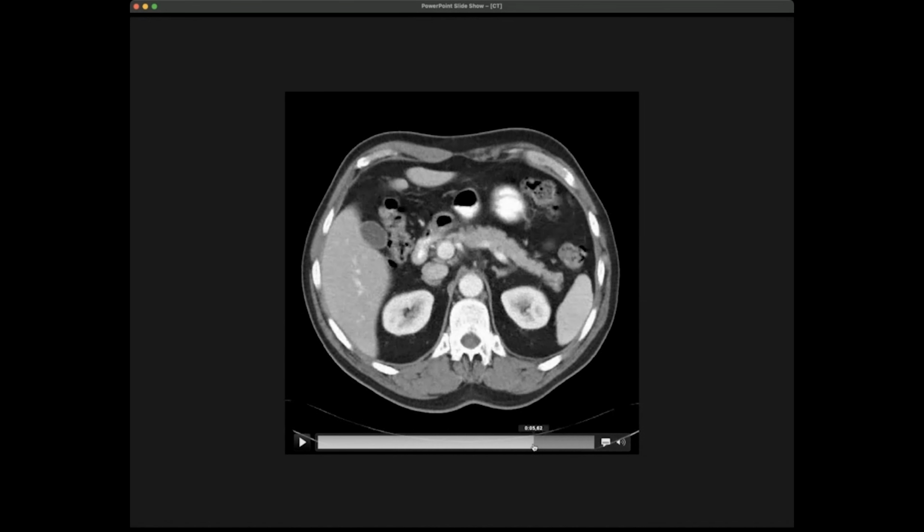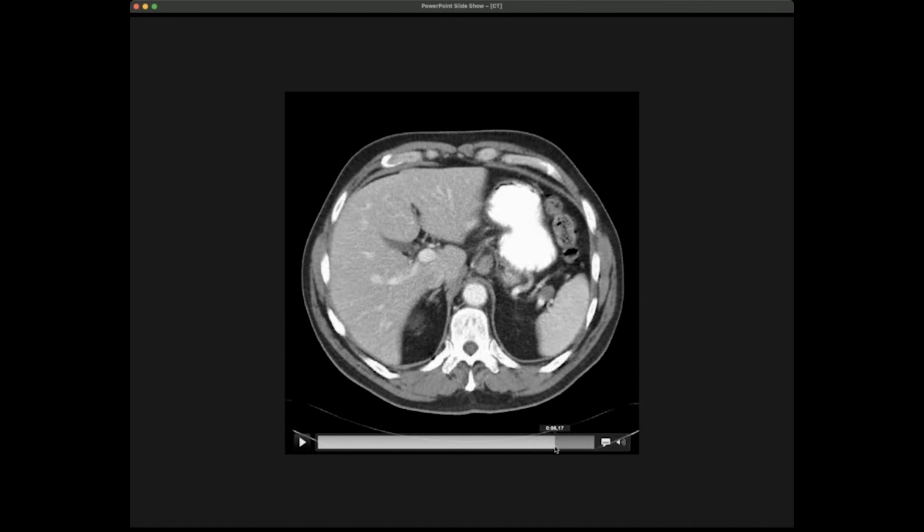Now, one thing, when you look at directions, you know that your liver is at the right side of your body. So normally, most people, 99% or something like that, have their heart at the left side and the liver at the right side of the body. What you see here on these images is that the liver is on the left side. And this is, in a way, a peculiarity. But this is by convention.